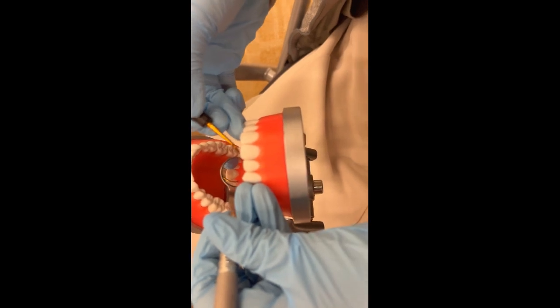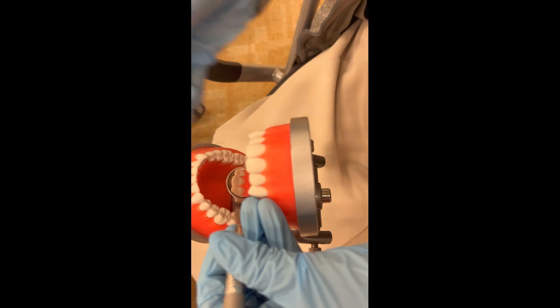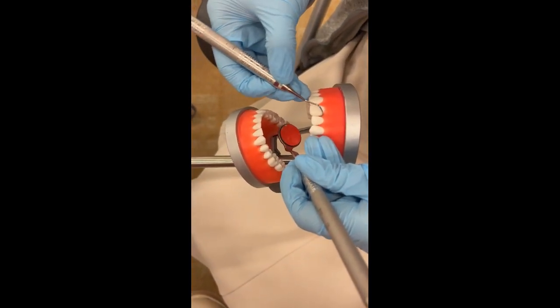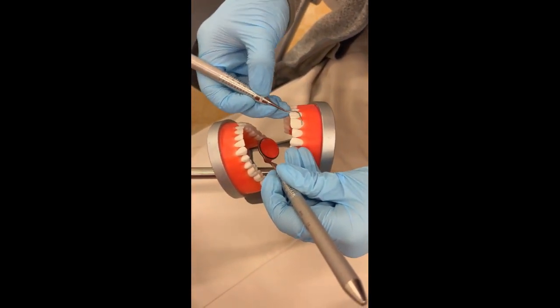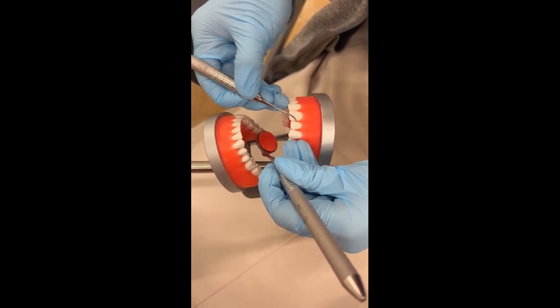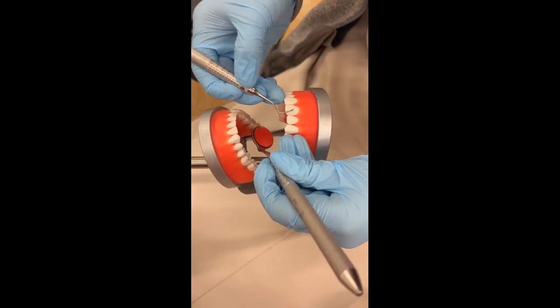meaning that it can be used on supra as well as subgingival surfaces. In the video, I am only using it on the supra surfaces, and I'm not going subgingivally. And I'm also scratching the tooth surface with the toe, and that's not how you use the instrument.